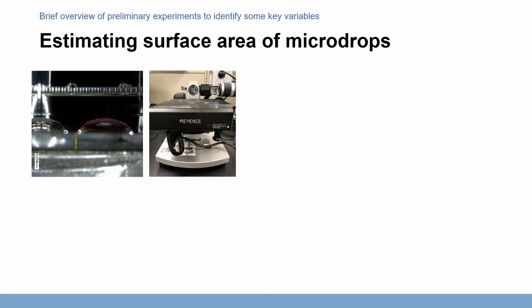And so initially I tried to understand what that surface area would be and try to estimate what that would be. And before I went on to this more sophisticated analysis approach here, I tried to estimate that simply by modeling them either as a hemisphere or an obloid spheroid. And I could never get very good estimates, in my opinion, at that point of the surface area approach. And so then I was informed of this microscope we have in an engineering testing laboratory at Cook, which would allow you to take side views of different objects.